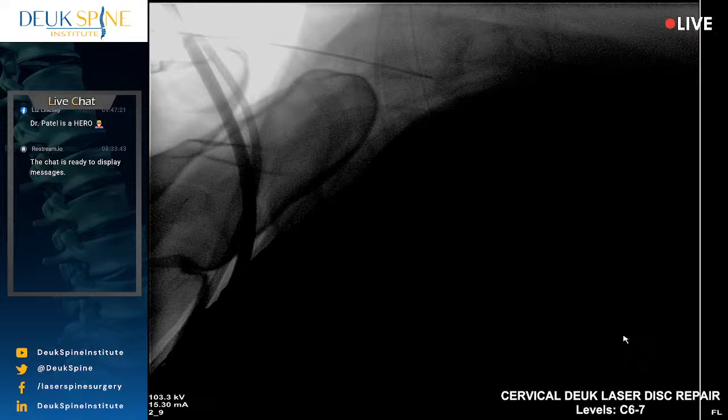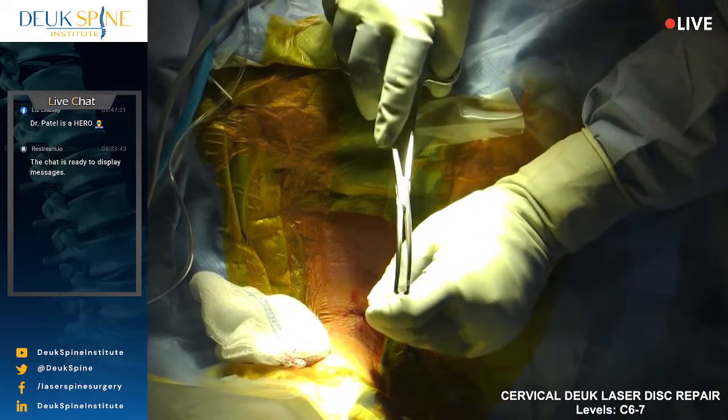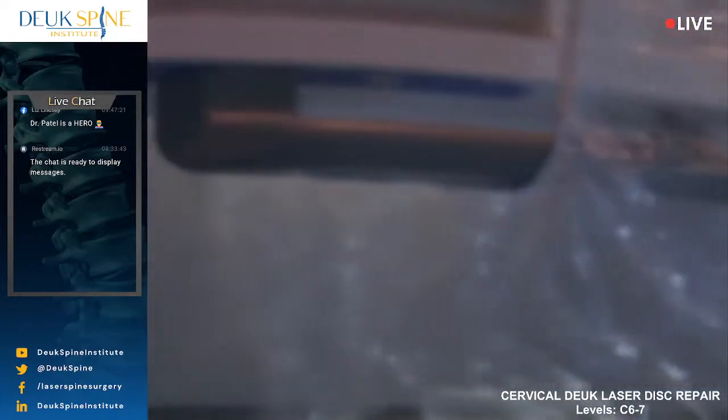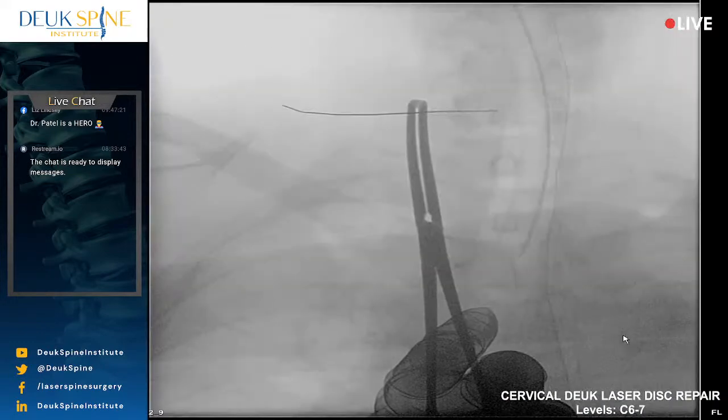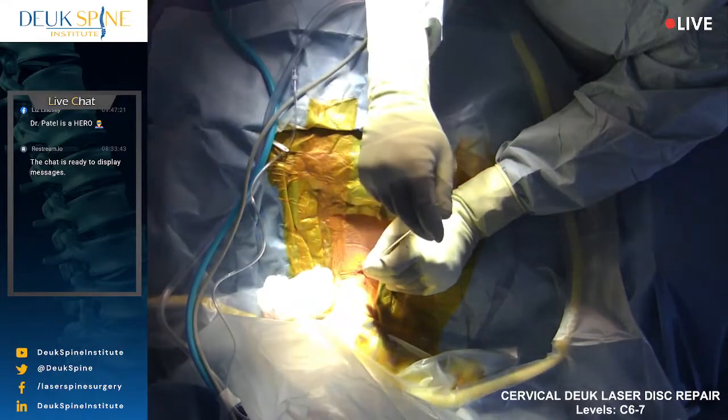Let's get an AP. Nobody move. It's a little bit of a tricky situation because, quite frankly, the patient's is a C6-7 disc, which is very hard to get to. I need a quick AP. Move your hand, please. Looks good. Lateral. We are on the front of the spine in the center where I want to be, but we're just on a bone spur sitting over the disc from the top, which is C6. So it's growing off the front of the spine at the bottom of C6 over the disc. And I'm sitting on that bone spur right now, and I cannot get through it with a needle.